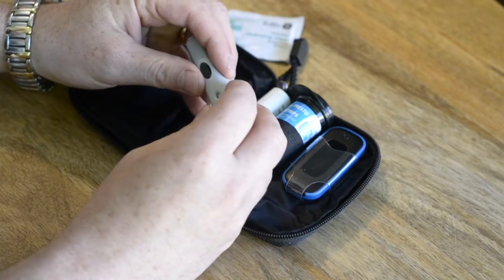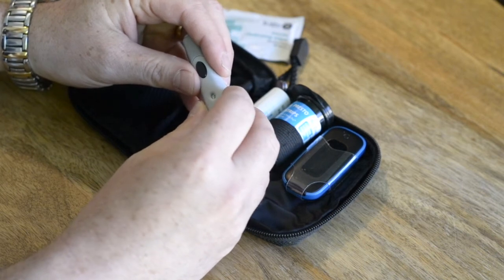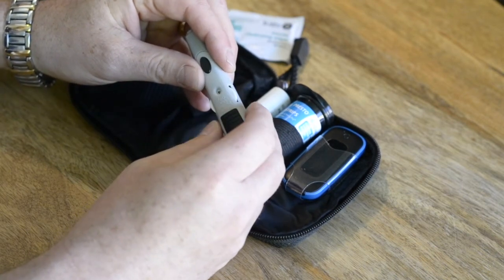Next, use the dial to set the intensity of the needle prick. 5 is the highest intensity.